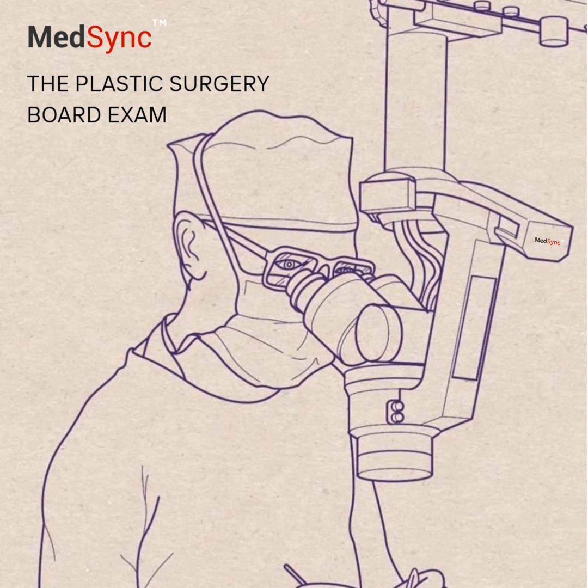Pulse delivery is key for targeting. What about Q-switched lasers? They have extremely short pulses, don't they? Extremely short, nanoseconds and picoseconds. They deliver massive energy bursts that create a photoacoustic effect, like a shock wave, which shatters small particles. Exactly. Great for tattoo pigment, melanin granules.